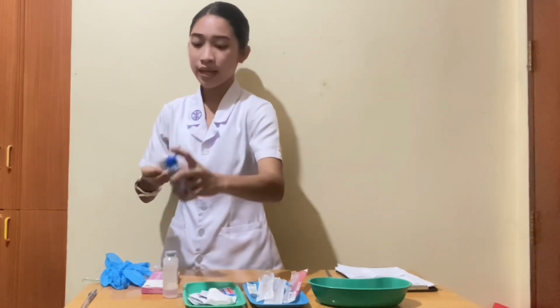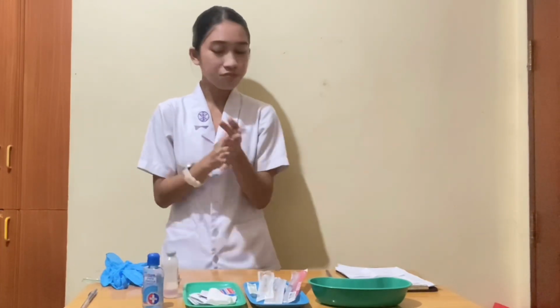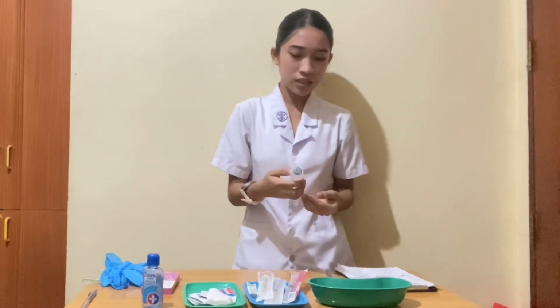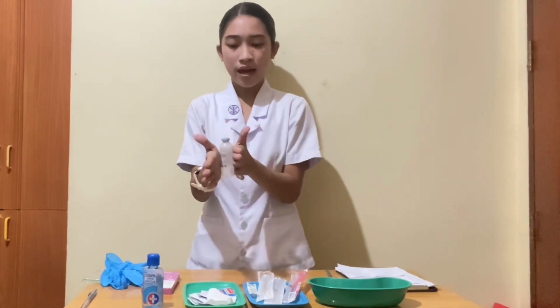Next is to read again the label of the medication before withdrawing the medication. This is sterile water 0.1 ml. Now, mix the solution by rotating between the palms of the hands. Avoid shaking it as it may foam the vial, so we need to avoid that.